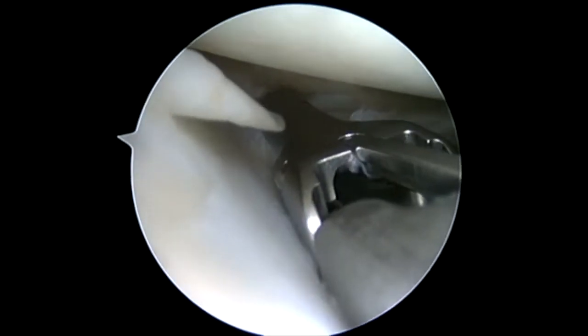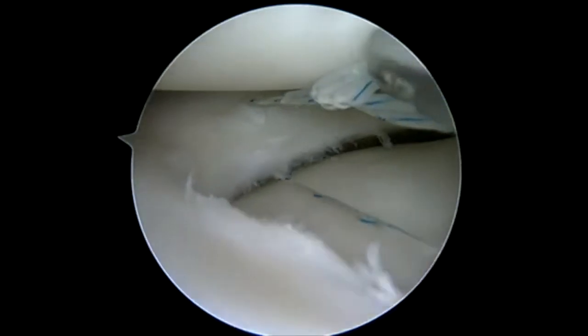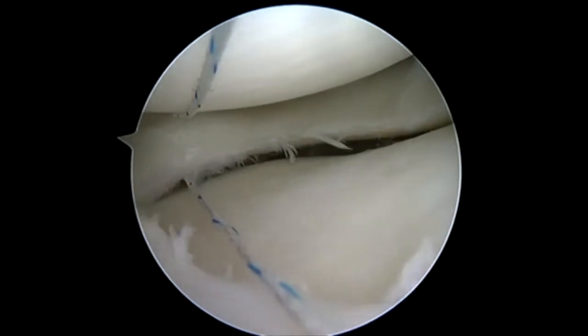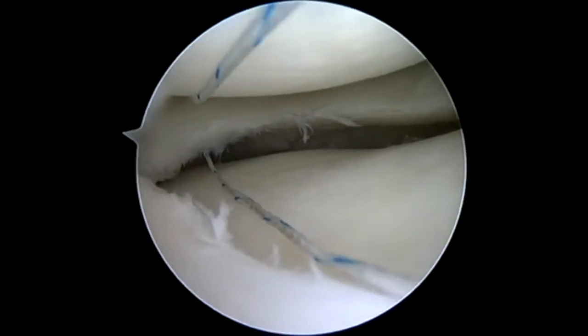So by making a more medial portal, like we would often make for a far medial portal for an ACL reconstruction, we're able to access a greater percentage of this meniscus.